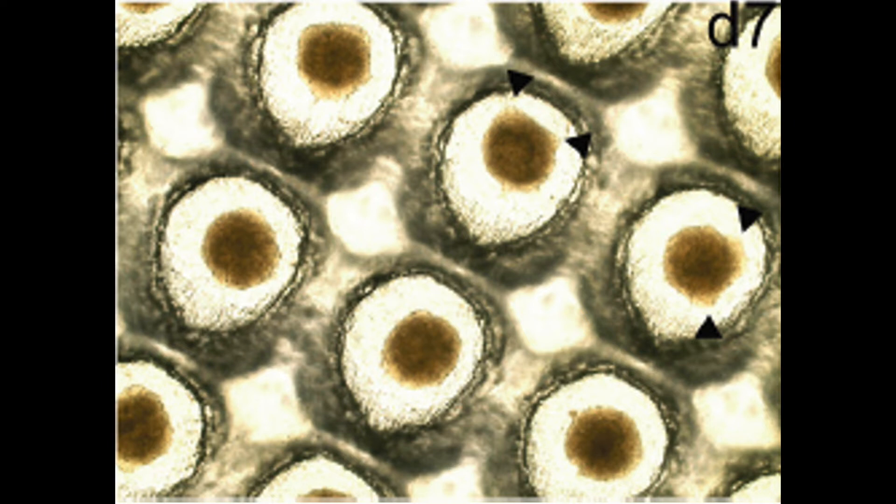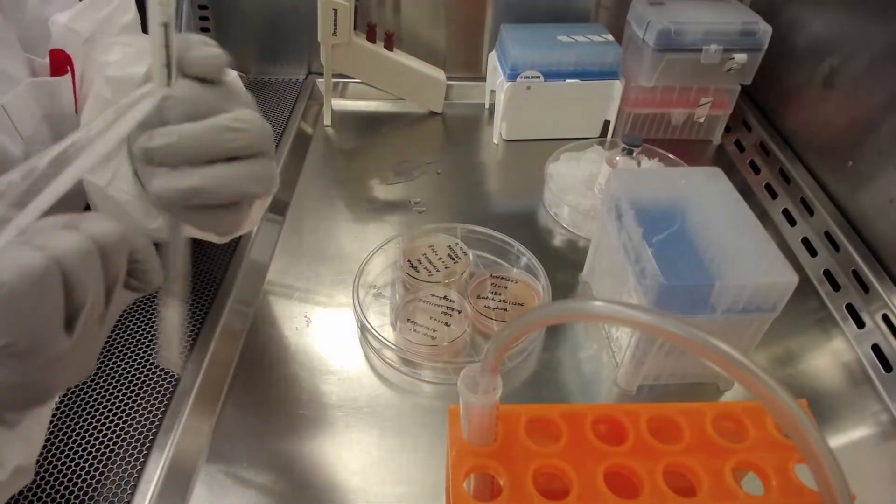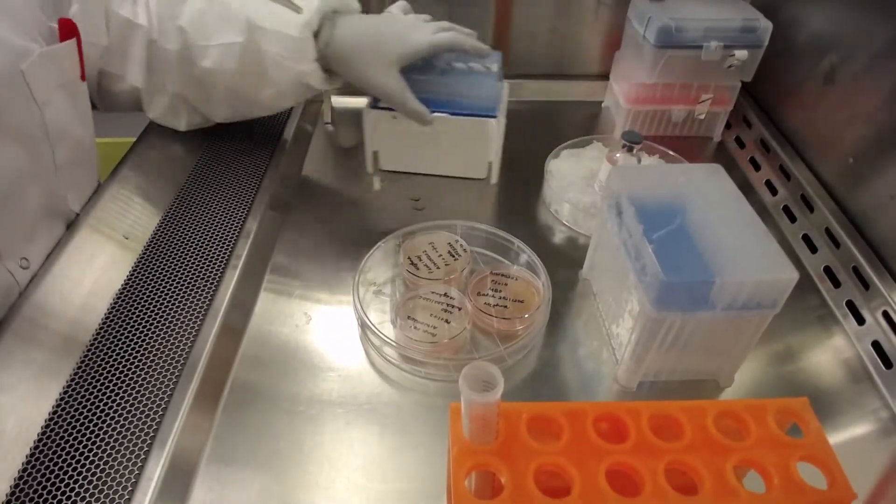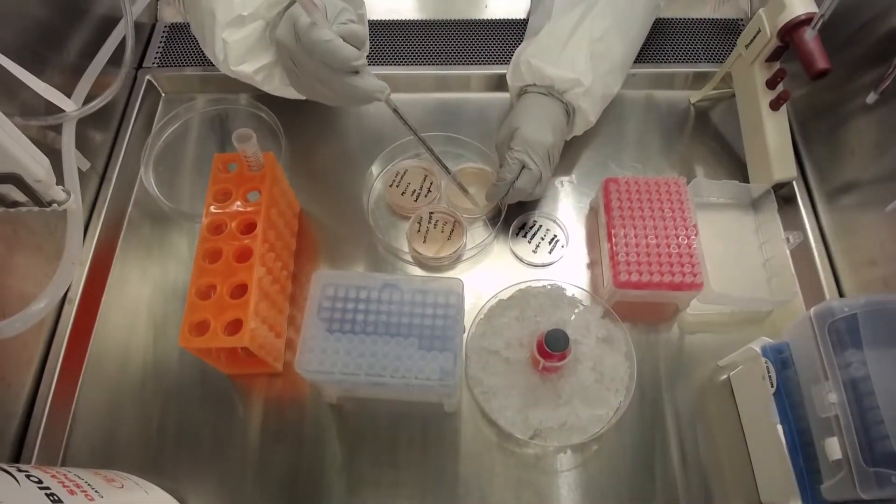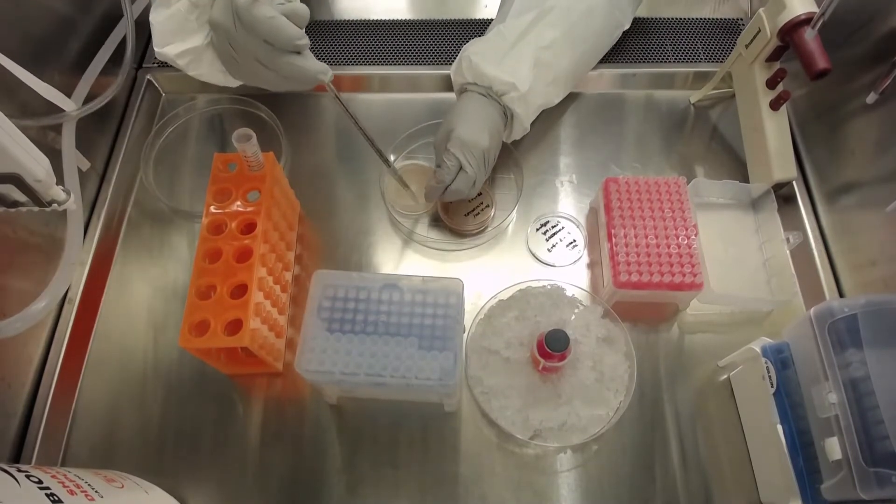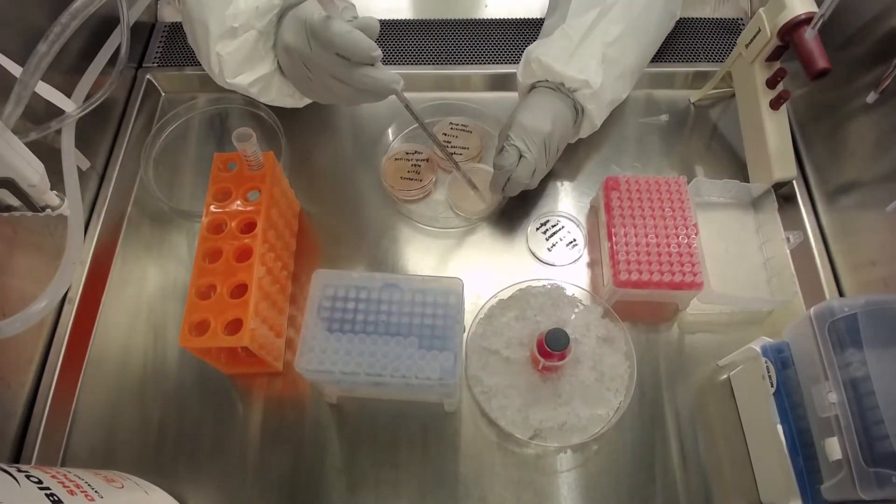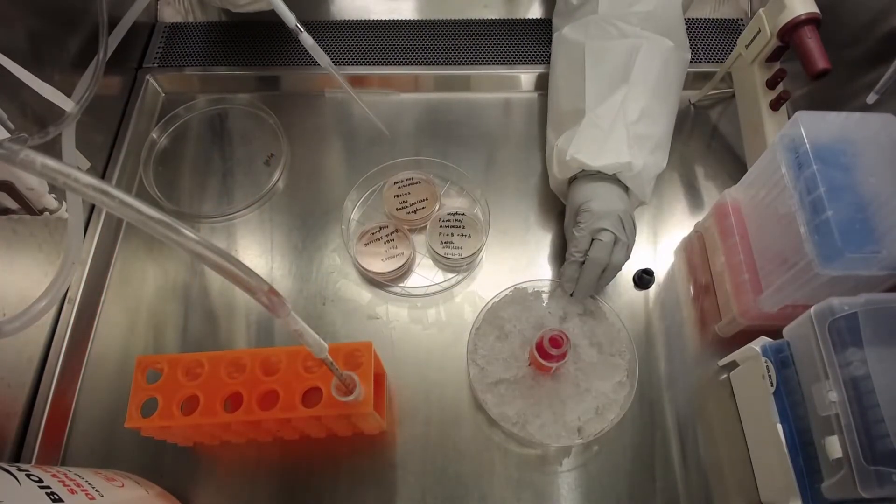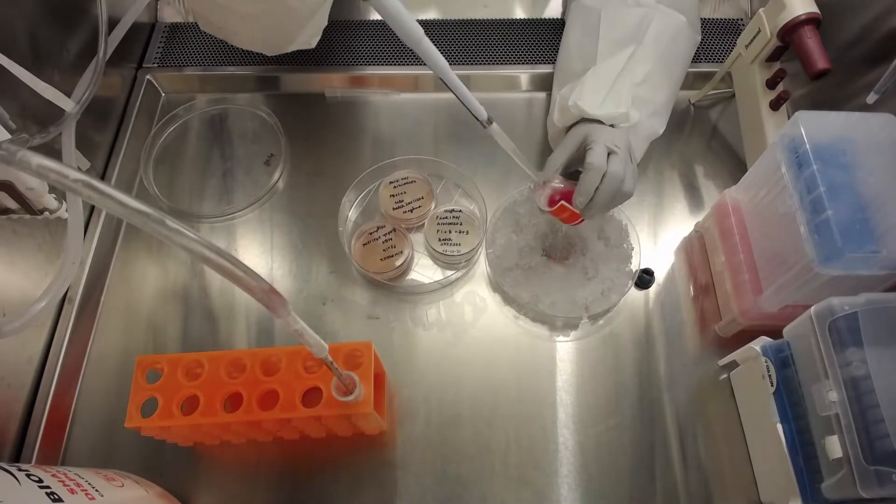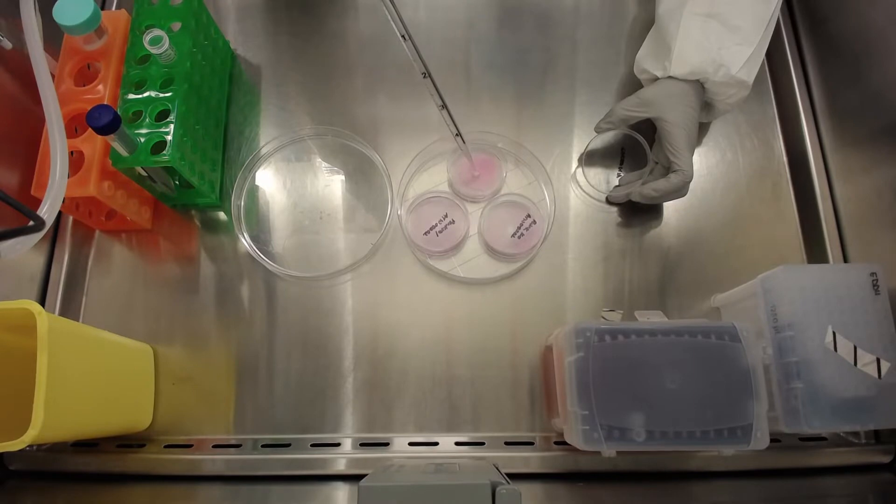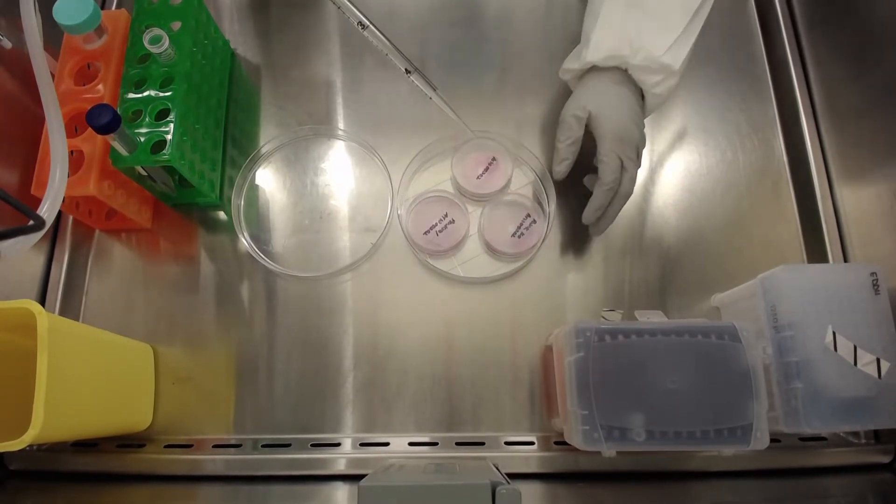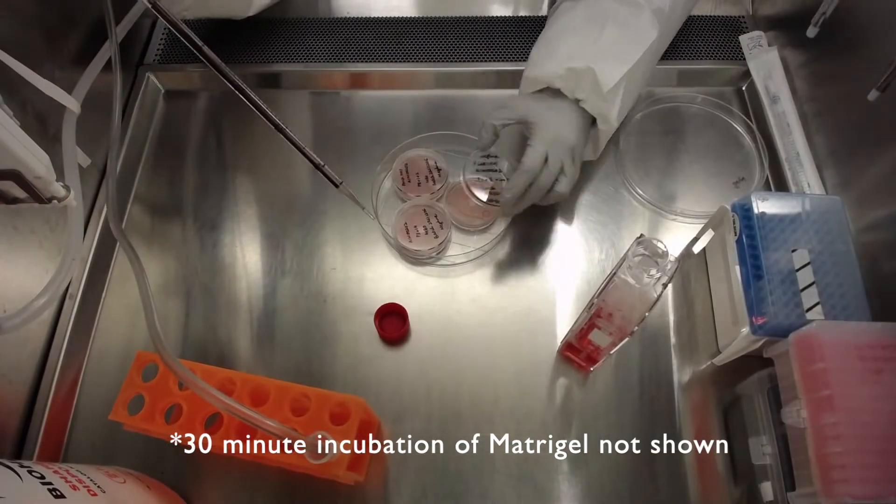Note that to embed EBs in Matrigel growth factor reduced, we use cold serological pipettes or pipette tips. Start the procedure by aspirating the media. Then, take 1.5 milliliters of non-diluted Matrigel growth factor reduced, and slowly add it to the center of the disc, to the platform. This way, Matrigel will evenly spread across all wells. Place the dish back into the incubator for 30 minutes.